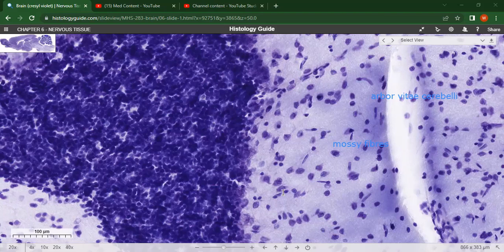So we have the intracerebellar nuclei. I've said there is the dentate, emboliform. There is also the fastigial, and the other one was globose. I've remembered it, globose. Remember, the dentate nucleus is associated with the neocerebellum.